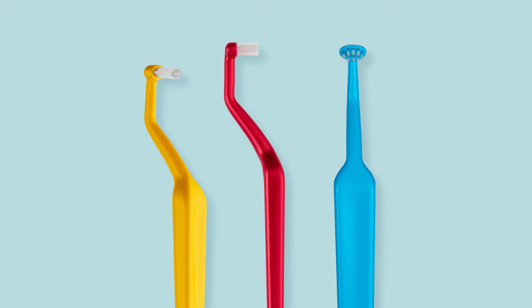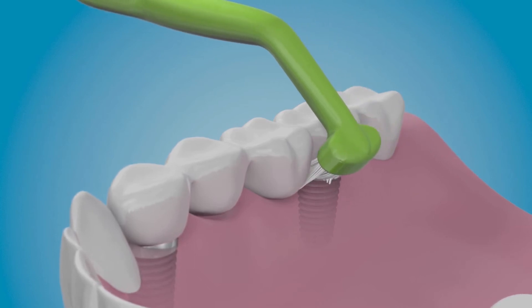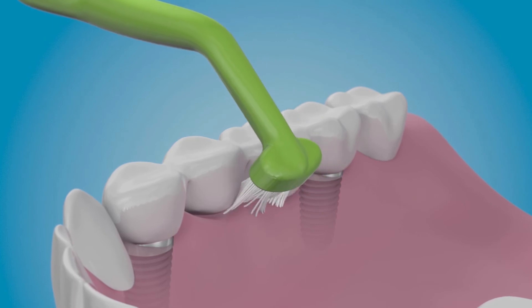Simply move the brush in a back-and-forth motion. This motion is preferred around single implants, the tongue-side of lower molars to prevent gag reflex, and the back of the last molar.